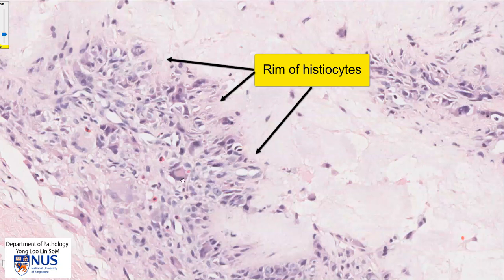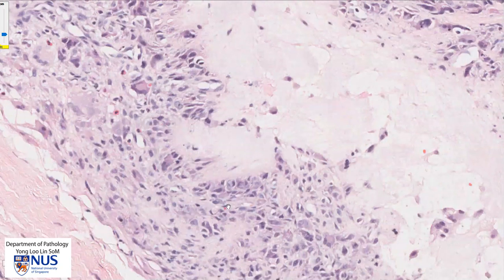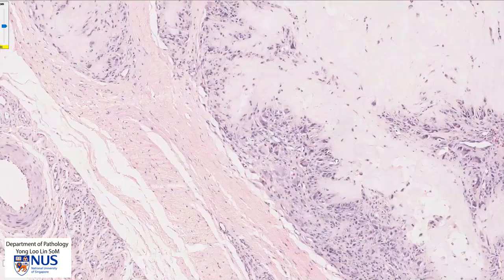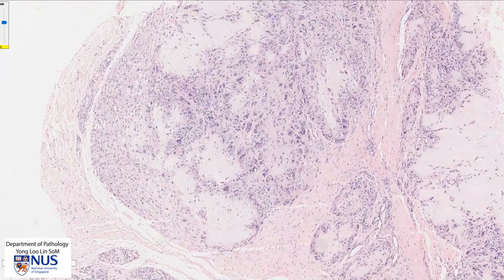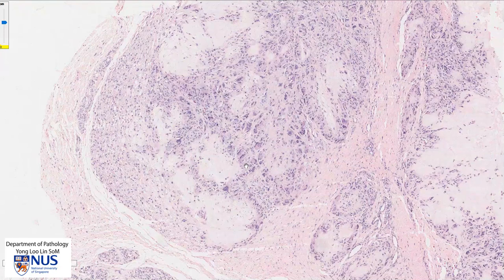Some of them are also multi-nucleated — these are foreign body type multi-nucleated giant cells. So we have both mononucleated as well as multi-nucleated histiocytes rimming these pale pink deposits, and surrounding this we have some fibrosis. This is the classical microscopic appearance of a gouty tophus.